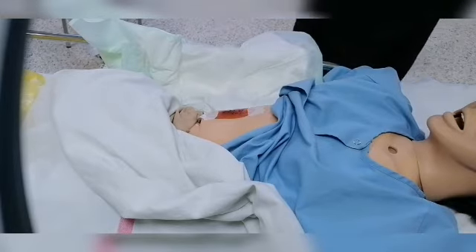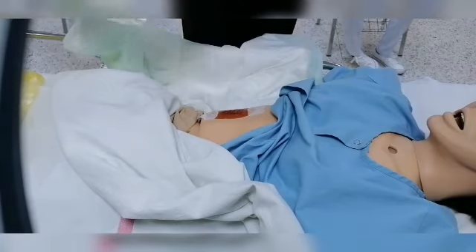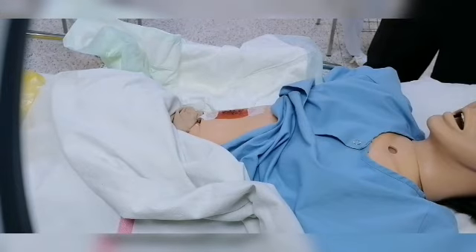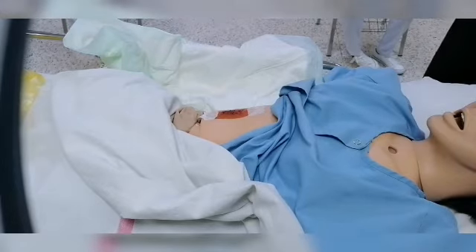So here I can use what we call the non-touch technique for opening it. So I just open it from outside.